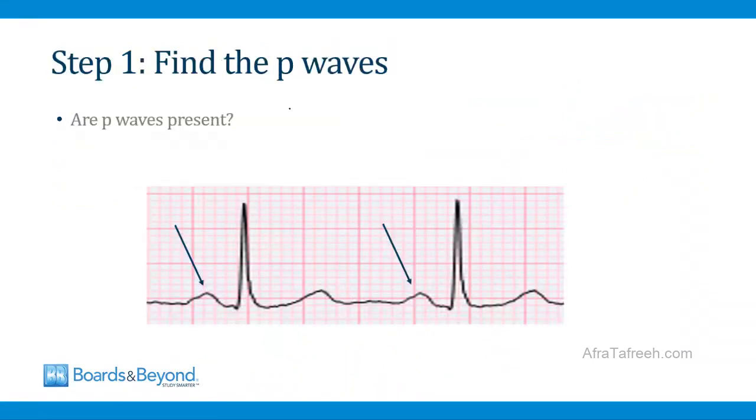So now we're going to move on and talk about how to interpret an EKG. Really, the only way to get good at interpreting EKGs is to look at lots of them and take care of lots of patients where interpretation of the ECG is important. But until you get to that point, there are a couple of systems you can use to interpret EKGs. And in the next few slides, I'll go through mine, which usually works for most of the EKGs that you'll see as a medical student.